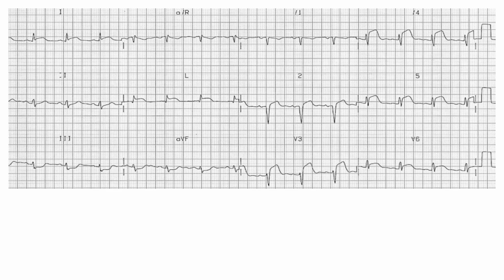Next ECG. Here you can see the clear-cut ST elevation in lead V2, V3, V4, V5, V6 also. Whenever I find ST elevation in V5 and V6, I told you V5 and V6 are lateral leads. So whenever you find ST elevation in V5, V6, that means there is lateral wall involvement. So you have to always look at lead 1 and aVL also, which correspond to the high lateral portion of the heart.